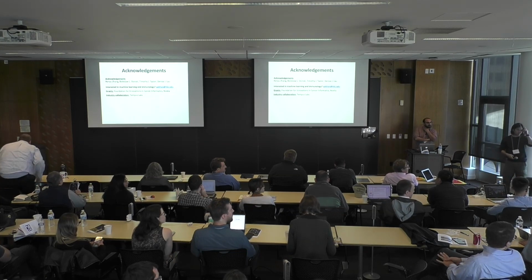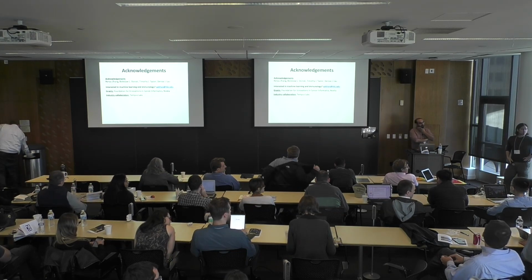But is there any possible bias introduced by specific tools or a specific microscope or dye that can confound the results? Yeah, absolutely. What we found is that image augmentation has a very important role in all of this. In our work, we've been trying to validate our methods on data from a different hospital. And one of the things we've noticed is that the luminescence of the scanner, the dyes, and everything else is going to play a role. One way to circumvent that, which people in vision have been doing for other tasks, is image augmentation, perturbing the training data to fit what you might see across sites. But it's an important thing, and better solutions have yet to be discovered.